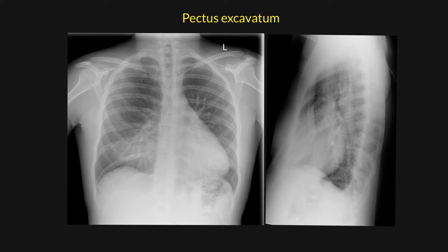This is a patient who has pectus excavatum, sometimes known as a funnel chest. The first thing to notice is that the right heart border is indistinct, and there is an increased density projected over it, and this is due to the pectus excavatum.